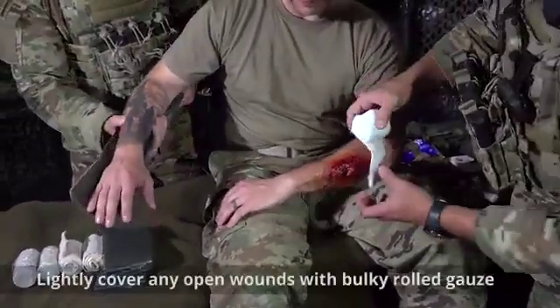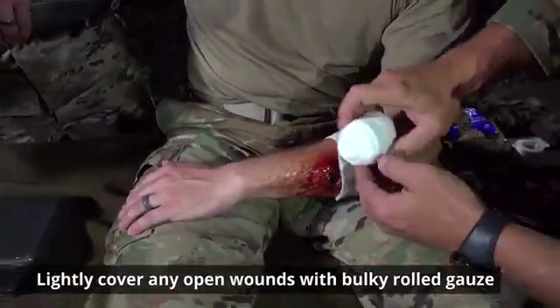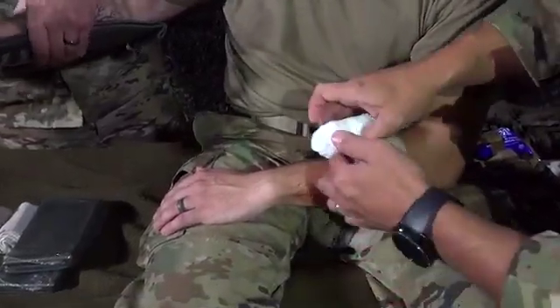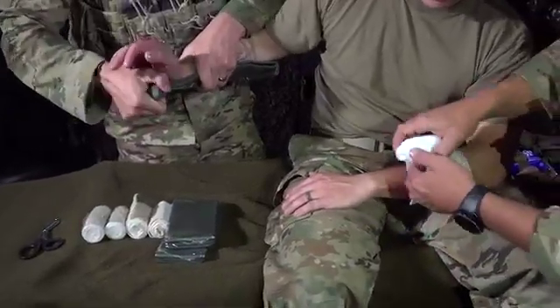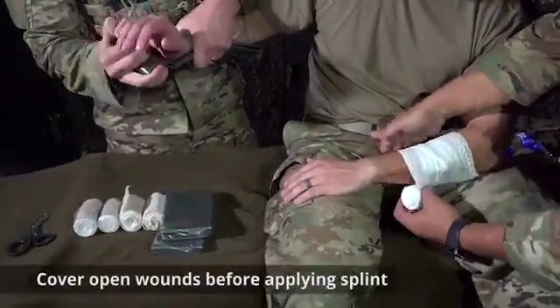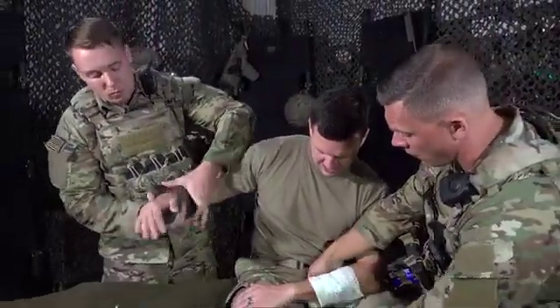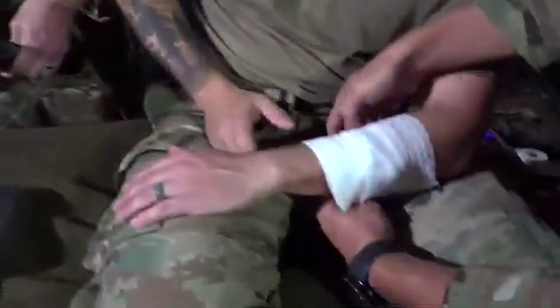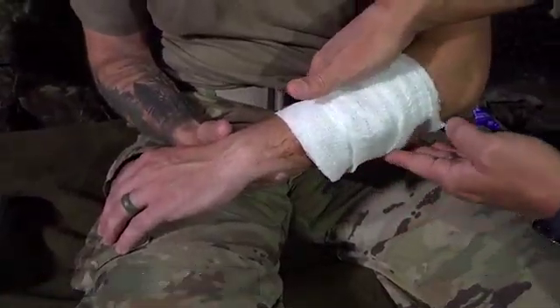While Jack is molding the splint, we still have this open wound on our casualty, so I'm going to very lightly put some bulky rolled gauze around it to help with sterility and infection precautions. I don't want to cause any more harm or pain, so I'm doing this really loose — and we want to get this on before the splint, so it doesn't have to be cut off over the splint at the next echelon of care. Then a little tape for good measure.